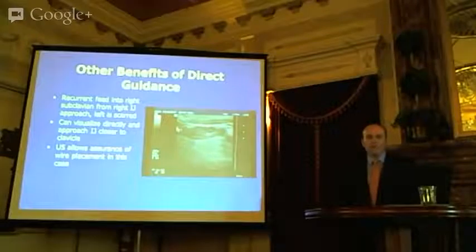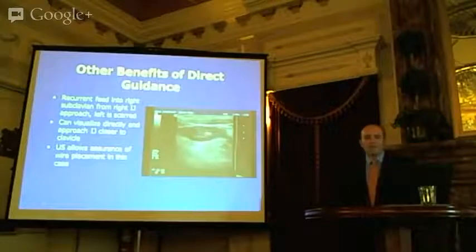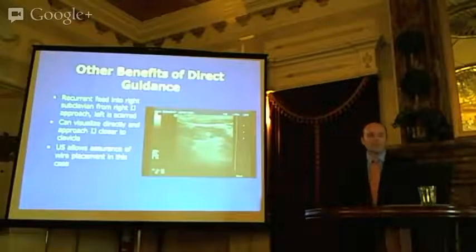This is another method. Nobody could feed a line in, multiple lines done. Did you notice how tight that was? There's a stenosis here. We were able to get that guide wire through. The triple lumen fit in there nicely. There was still lots of room, but blindly, we just weren't able to do this. And here's the problem: I had to drive the needle and point the wire directly down the IJ so it could really come in there and place the line. There were no other access options in this patient. She was that sick for so long.